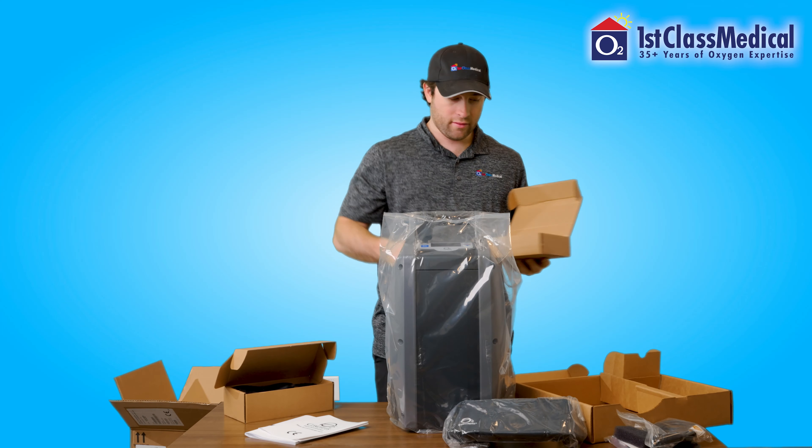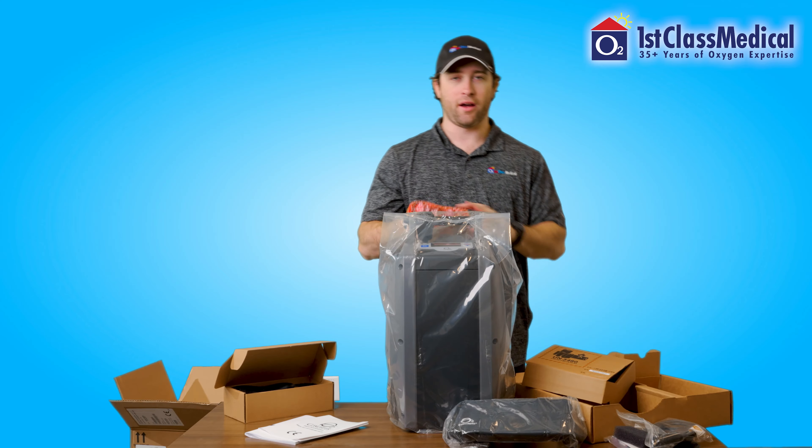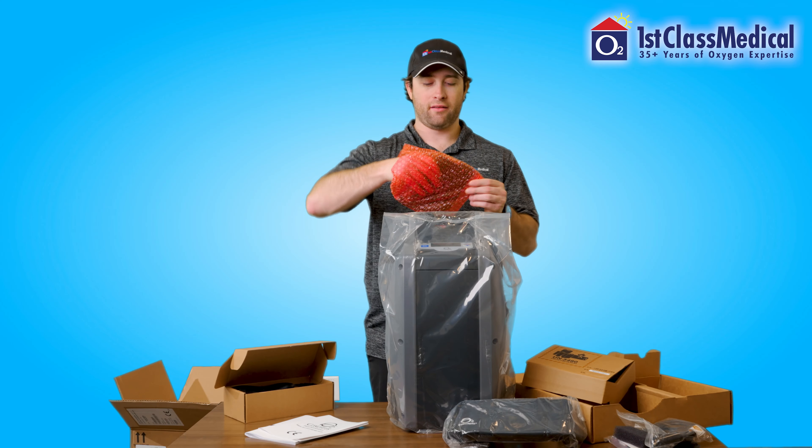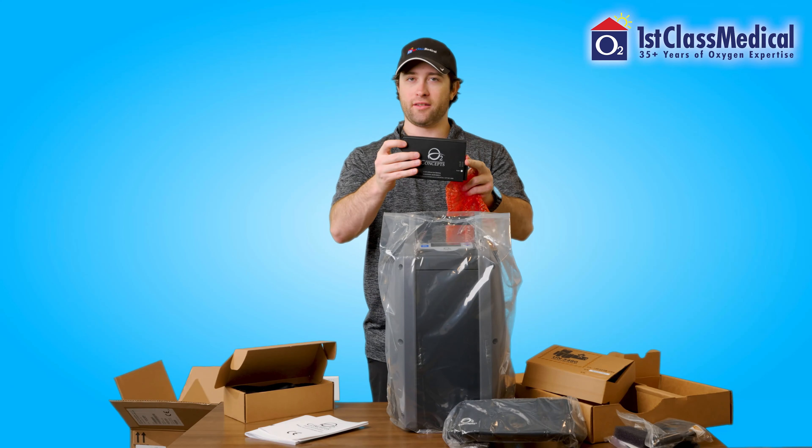And then, of course, you will receive a lithium ion rechargeable battery that will go in the unit itself.